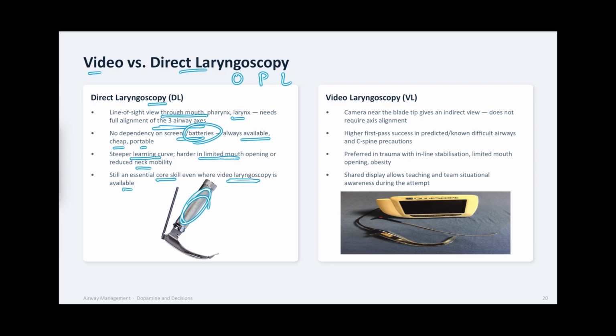The one which is being shown over here is a different kind of laryngoscope, that is the McCoy laryngoscope. The advantage of this is that, if you could see over here, there is a lever over here. If you press the handle over here, this will further lift the epiglottis.